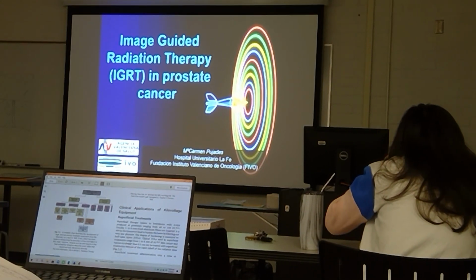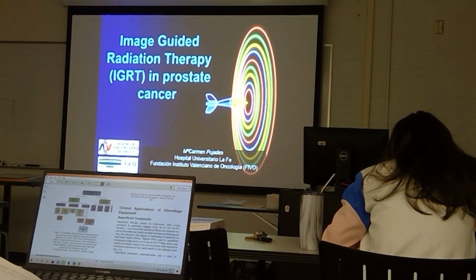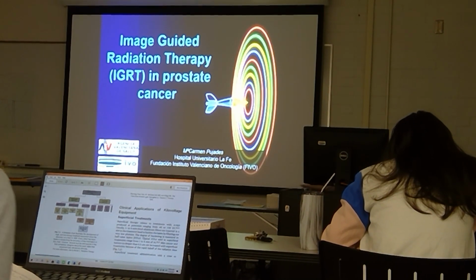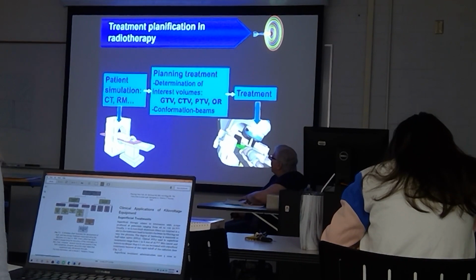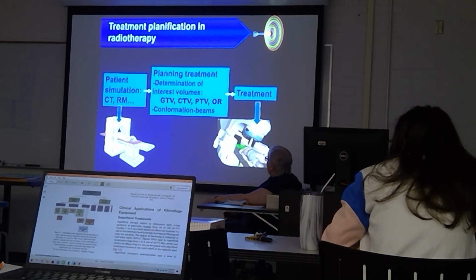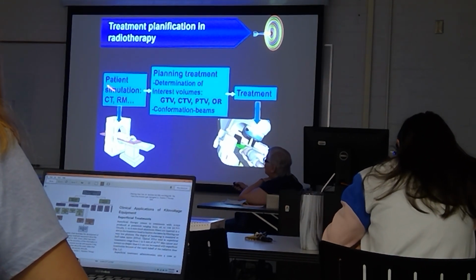IGRT, image guided radiation therapy, and this is in prostate cancer. So, treatment planning. Okay, so you have a patient, you do the CT.